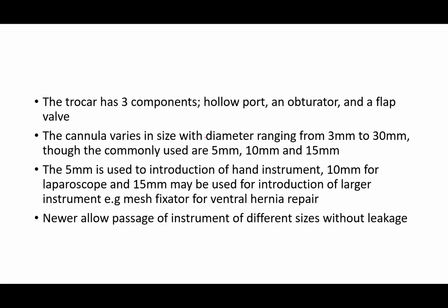Now, you should know that newer ports allow passage of instruments of different sizes without leakage. With the newer, especially the disposable plastic ports, irrespective of the diameter or caliber of the port, you can pass a smaller instrument, 5 millimeter, through a 10 millimeter port without leakage, and of course, the normal 10 millimeter through a 10 millimeter port.